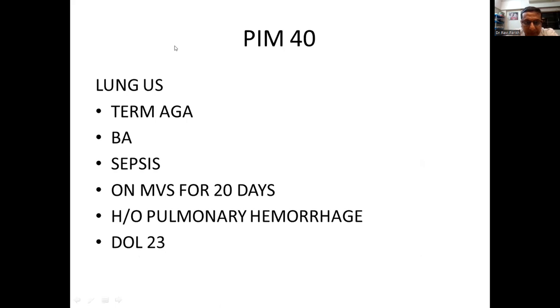Yeah, hello. Starting. So this was a term AGA baby with birth asphyxia, and the baby had sepsis, and the baby actually presented to me around the 19th or 20th day of life. That neonate was admitted in some other hospital and was on a ventilator for almost 15 to 20 days over there. And in the summary, we got to know that there was a history of pulmonary hemorrhage also for that baby. So this ultrasound was done on day 23 of life.